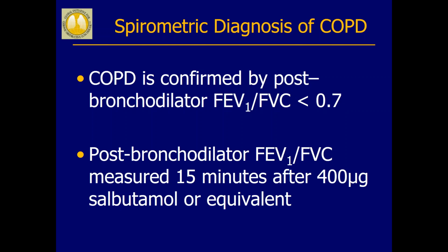Here they put salbutamol, but albuterol is probably the more common one. When they have the hands-on training, they'll go over that a little bit more on the bronchodilators you can use, the inhalers versus nebulized medications. But albuterol is what you typically use. And then in the hands-on training and the pharmacy on-site training, you can discuss whether using an albuterol inhaler versus an albuterol nebulizer works for your clinic.